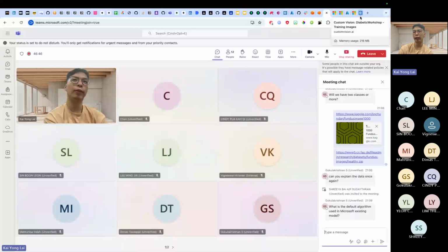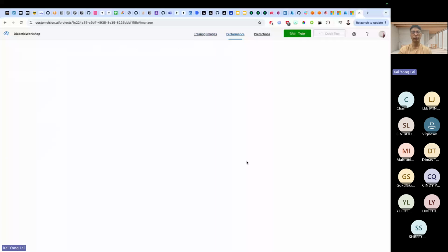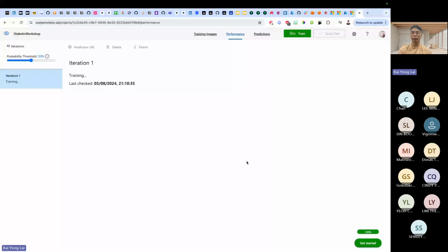because of how the algorithm is structured and everything. You can look into the details of how the algorithms work. I wouldn't touch it today because it would be very complex for those who are very new to AI, right? So now you should have the negative data and the positive data. Now what we are going to do is train our model. So for train, click on quick training. Just go into that. Now it will train our models with the training images that we have. All right.